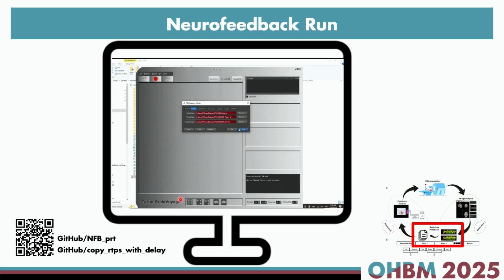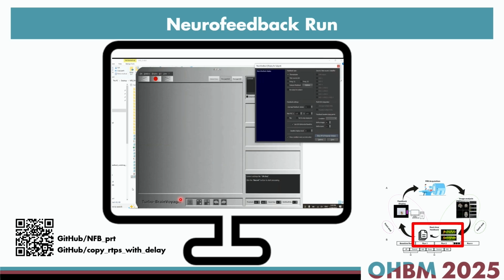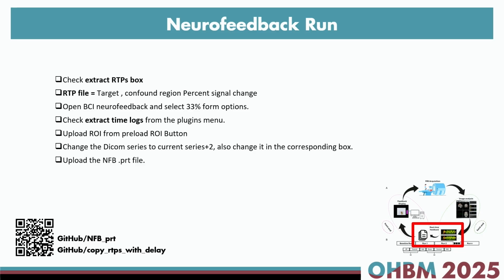And this was the troubleshooting, or the reason behind doing all these pilot scans again and again, because you need to have a good checklist of what you need to do. Just setting all these parameters based on the needs of your specific experiment is so important. So keep in mind to activate any option that you need. Yeah, just briefly check extract time logs, which was the delay of processing, if you need to.